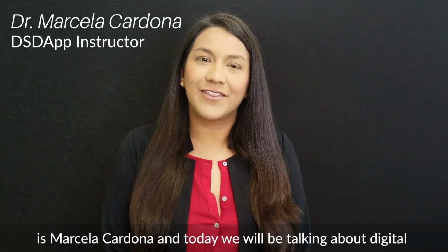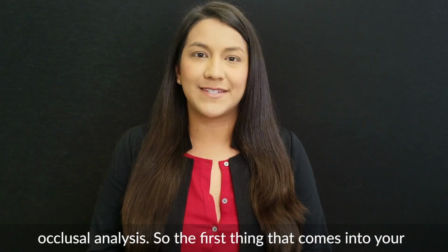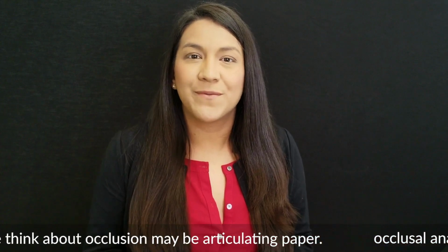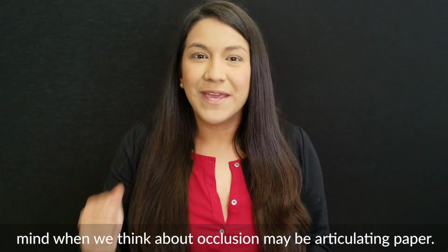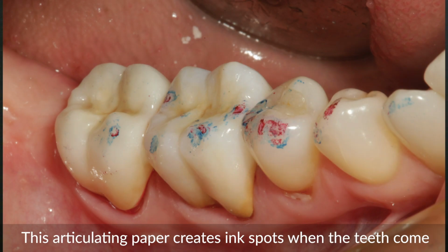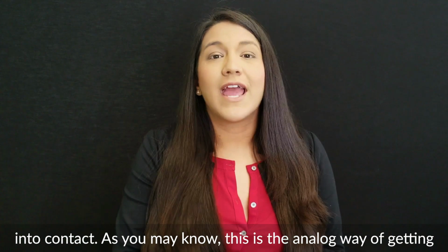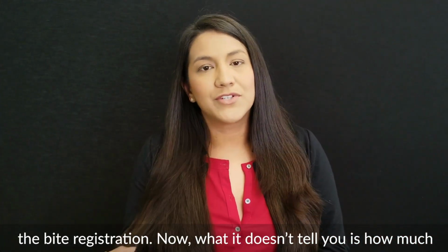My name is Marcela Cardona, and today we will be talking about digital occlusal analysis. So the first thing that comes to your mind when we think about occlusion may be articulating paper. This articulating paper creates ink spots when the teeth come into contact. As you may know, this is the analog way of getting the bite registration.